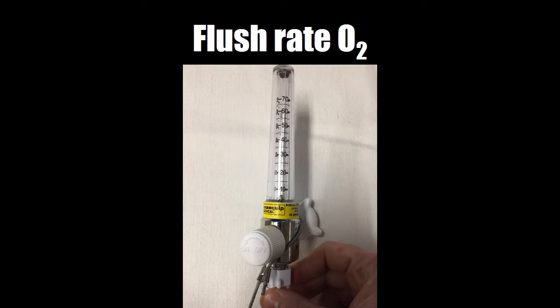But if we were delivering 40 litres per minute plus via our non-rebreather, and we can overcrank the nasal cannulae as well if needs be, we would be getting a much better FiO2 for these patients. And that goes back to the belt and braces approach of essentially increasing the safety, buying us more time, increasing our safe apnea period. These cost about $140 each. And my feeling would be that we should be switching out our flow meters in resus to a higher rate flow meter like this. Just being aware that the little old lady in resus who's on nasal cannulae at 2 litres per minute may be hitting the ceiling if we inadvertently have this.